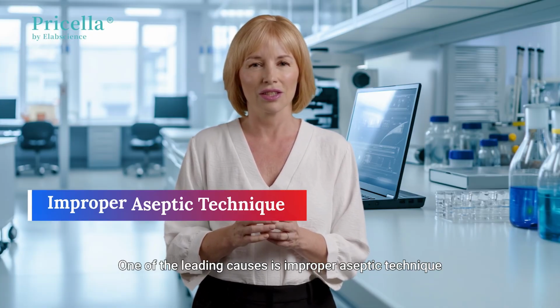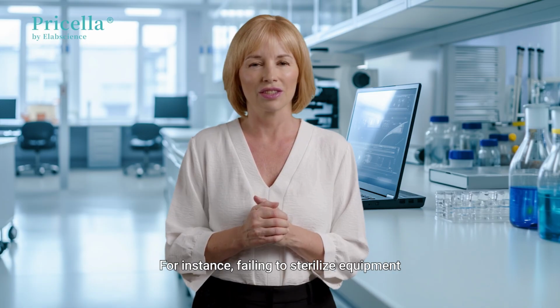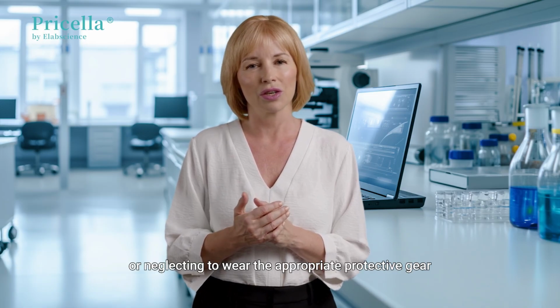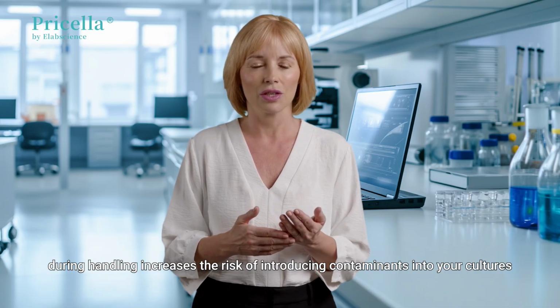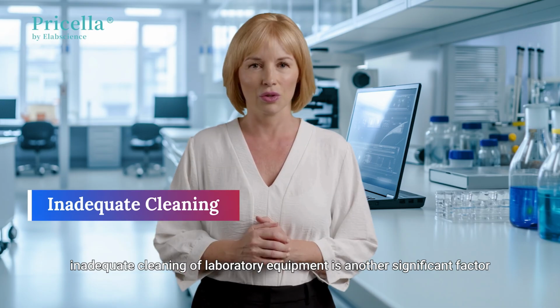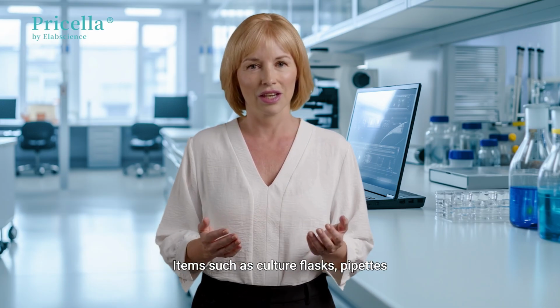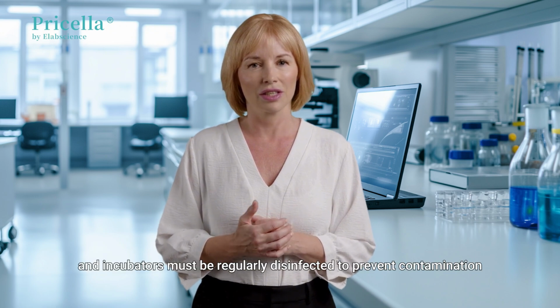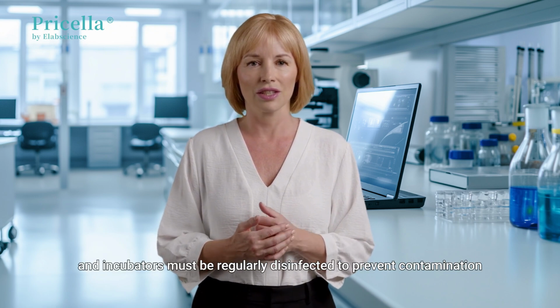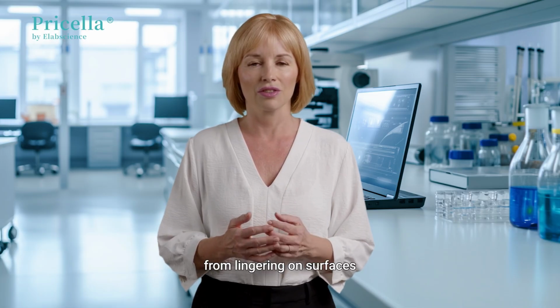One of the leading causes is improper aseptic technique. For instance, failing to sterilize equipment or neglecting to wear the appropriate protective gear during handling increases the risk of introducing contaminants into your cultures. In addition, inadequate cleaning of laboratory equipment is another significant factor. Items such as culture flasks, pipettes, and incubators must be regularly disinfected to prevent contamination from lingering on surfaces.